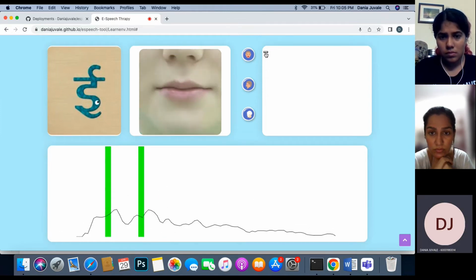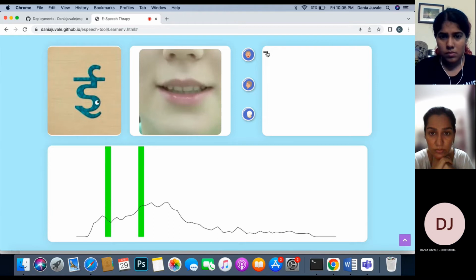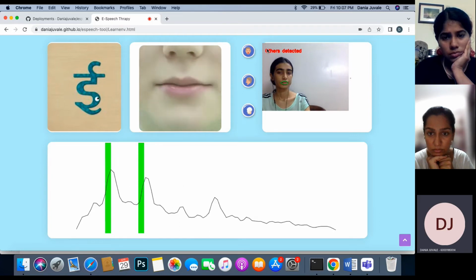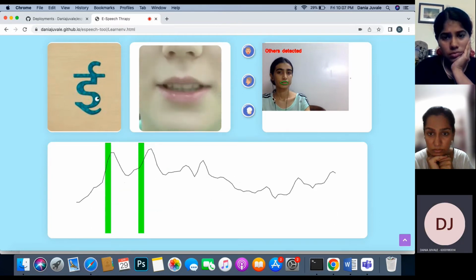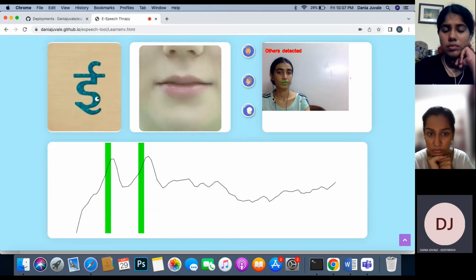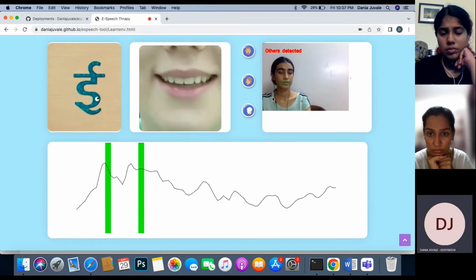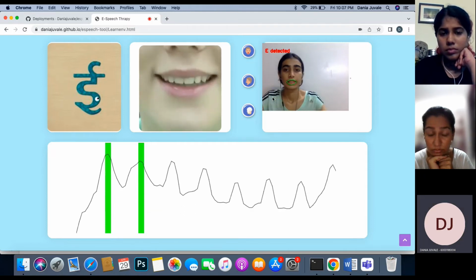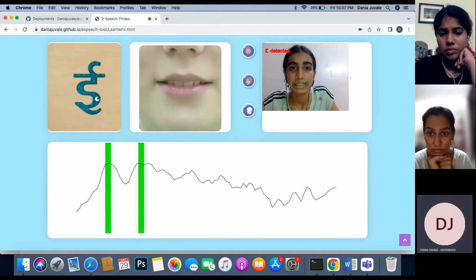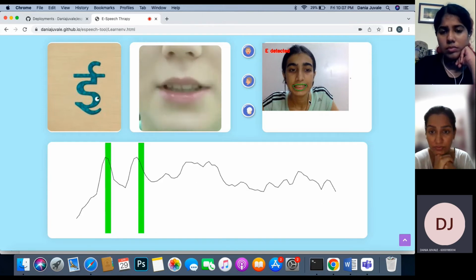So to enable the video, I have to press this button here. E. So as I said earlier, because we are using Socket IO, there is a certain lag when it comes to the server FPS and the website FPS. So this is one of the limitations that we have experienced while using Socket IO. As you can see, there is a lag, but it is detecting E. I can run the same file on Jupyter Notebook to show you the accurate results for it.